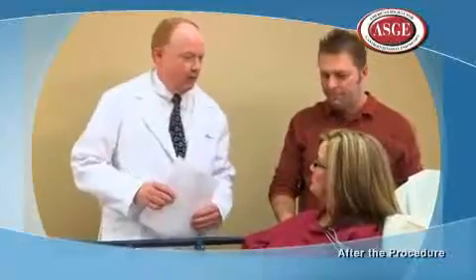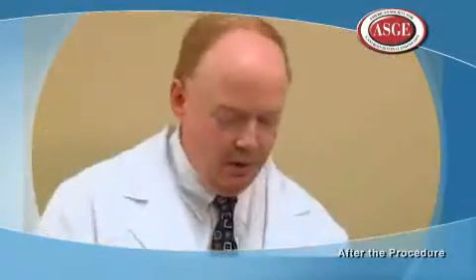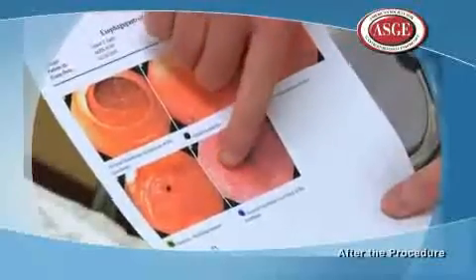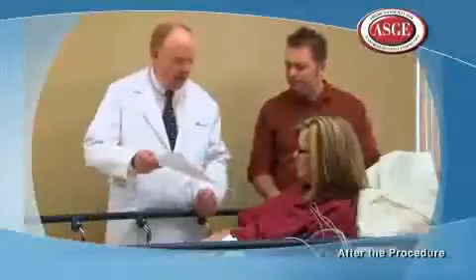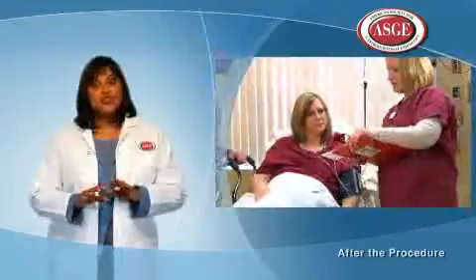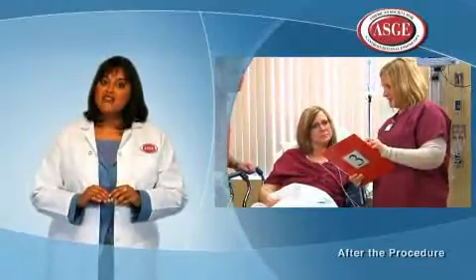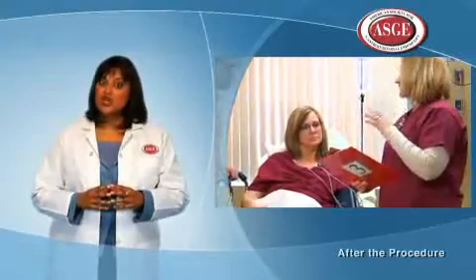Before leaving your endoscopy appointment, you will know at least the preliminary results of your exam. It's quite common to have tissue samples taken during the test. This does not necessarily mean that anything is wrong. Any tissue removed will be sent to a doctor called a pathologist. This doctor will look at the tissue under a microscope. These results will not be ready right away and generally take several days to be completed. Before leaving the doctor's office, a member of the endoscopy team will suggest how best to check on those results.